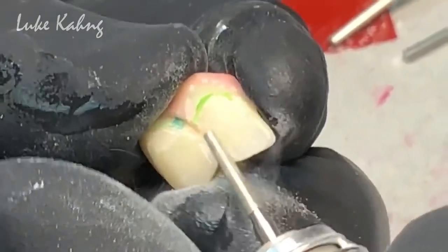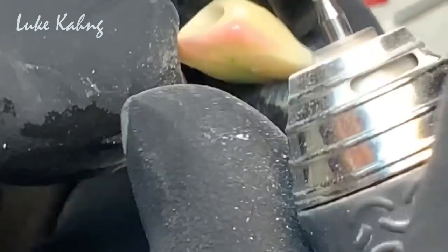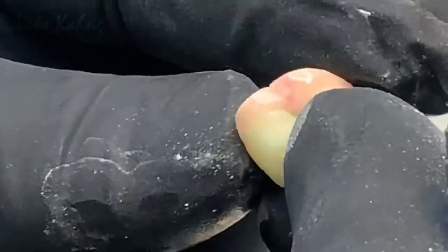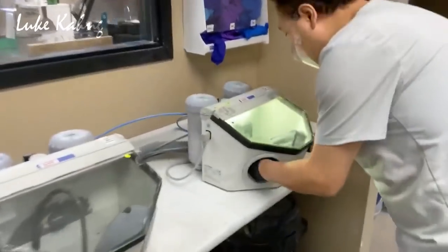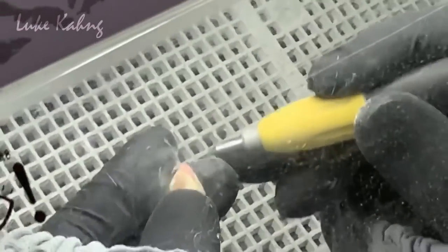I'll prep a little bit more here because it will change the color a bit. I don't think we need this. Here's the feature contour, there's the neck. I'm going to steam it, then sandblast it. Clean underneath too. The reason I sandblast — I don't want to see it looking glassy. That's good.